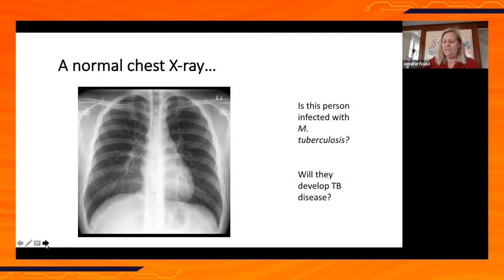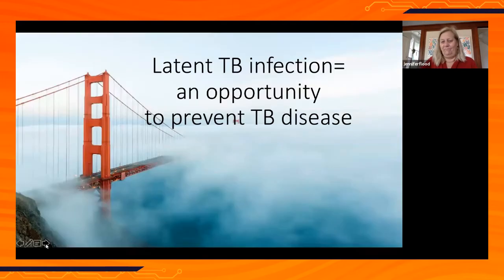Now, this last film is a normal one. Most of your applicants will have a normal chest x-ray. The question is whether they are infected with TB bacteria. I want to spend the next few minutes discussing latent TB infection, what it is and why it is important.